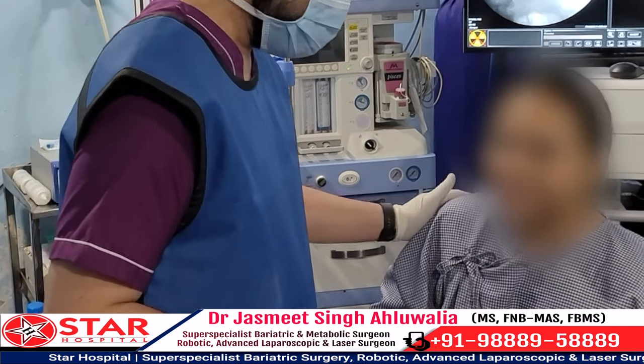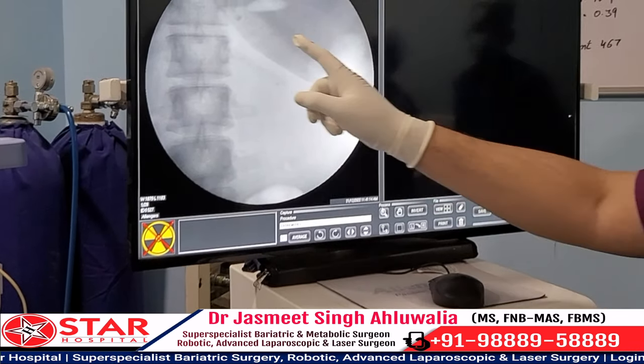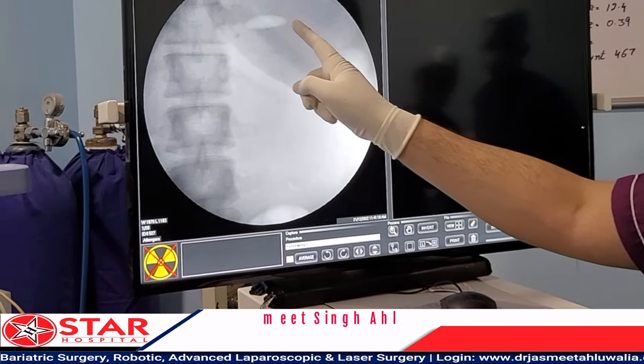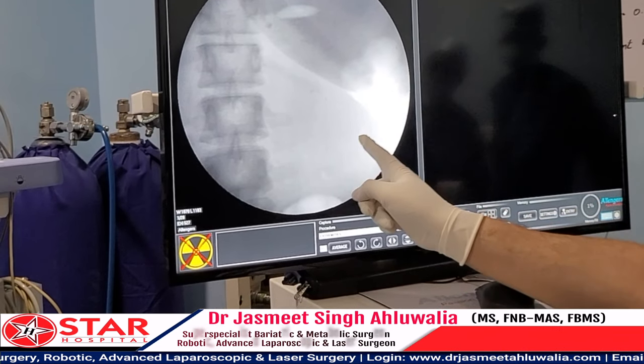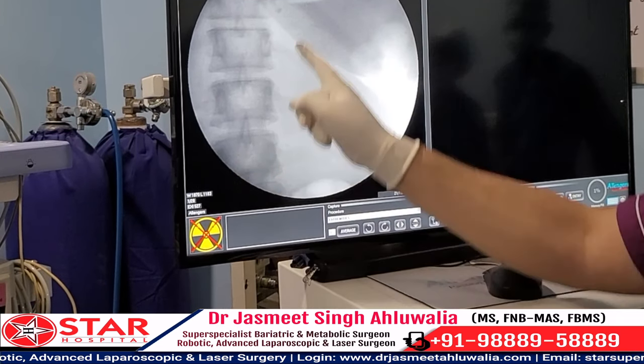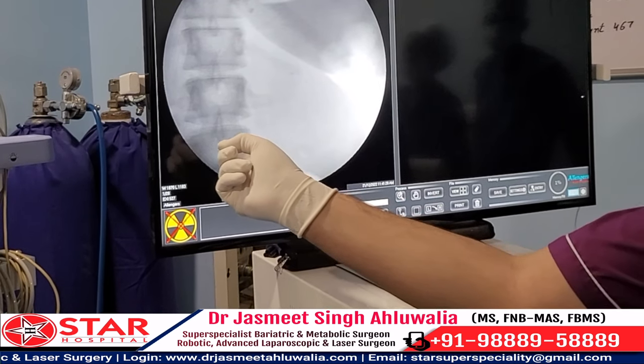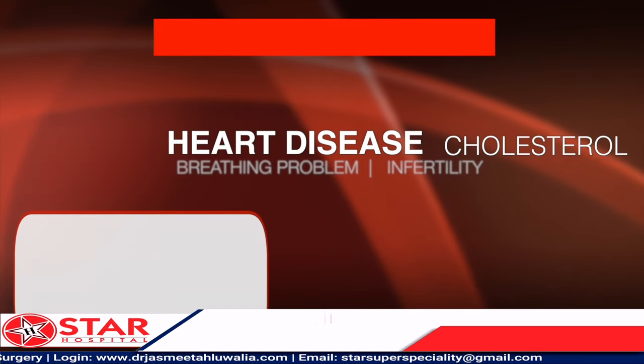We are showing the balloon to the patient. This is the top end where there is a little ear inside the balloon, and this is the outside marking of the balloon — a little hard to see, but it can be made out. This gives confidence to the patient that she will do very well with the weight loss that this balloon is going to bring about.